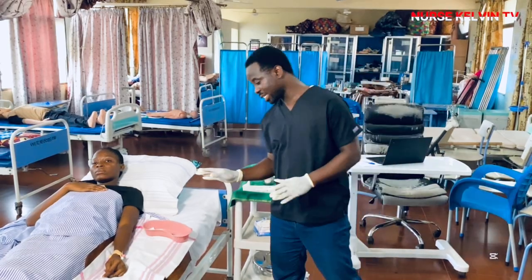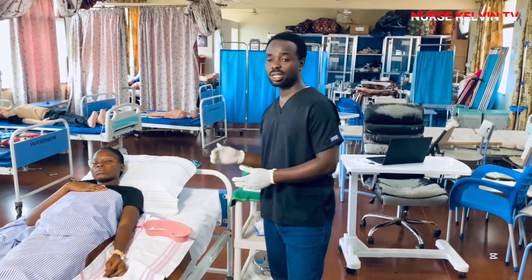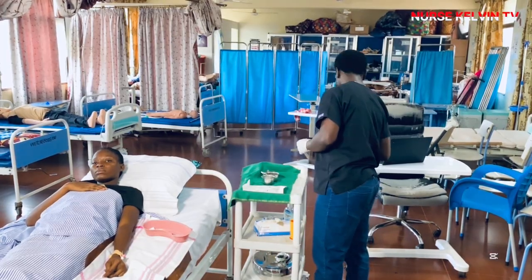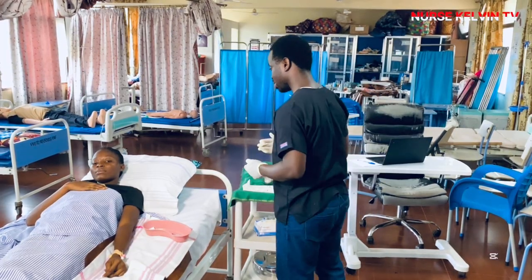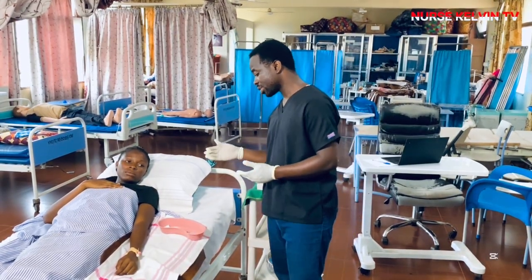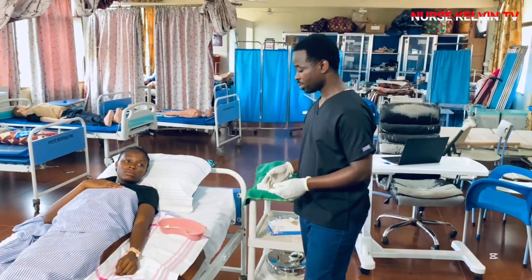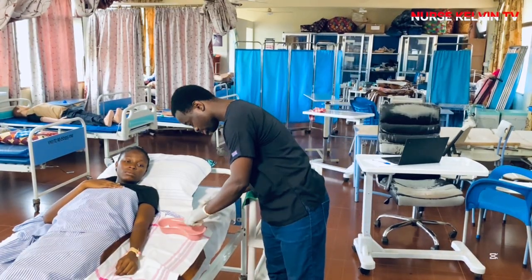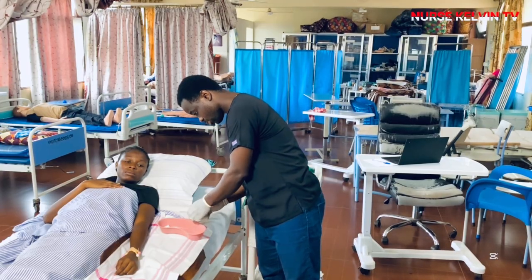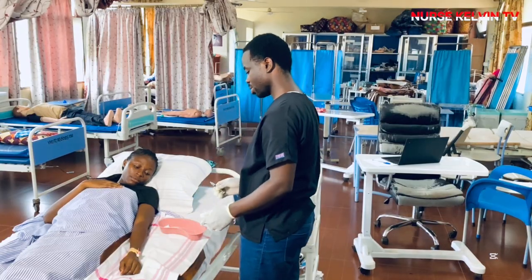So I'll do the third check of the medication: the right time, the right dose, and then the right patient. That's all, Mrs. Augustina. So I'm done with the third check. So you have to check the patient name, medication, time, and then the dose.